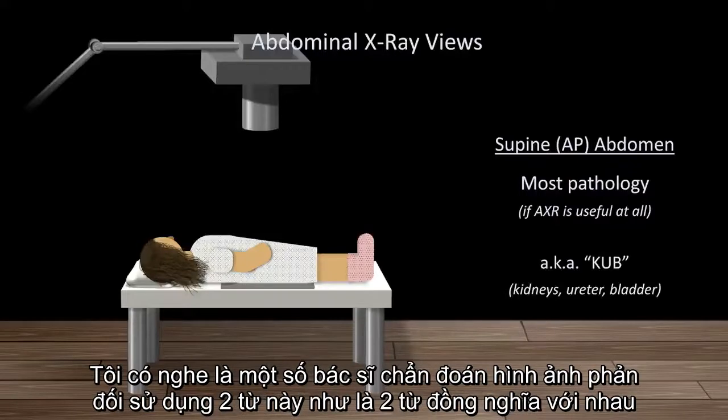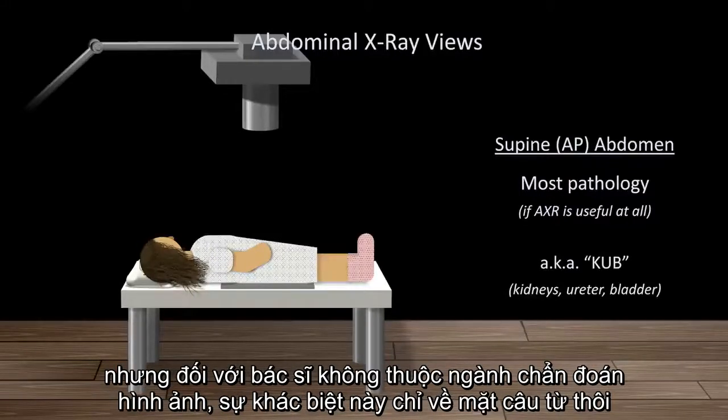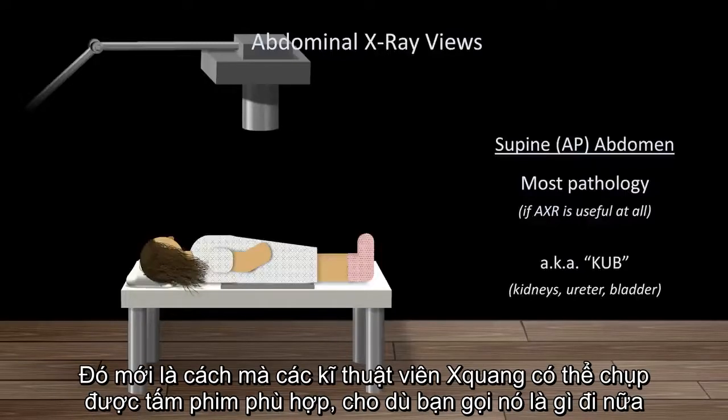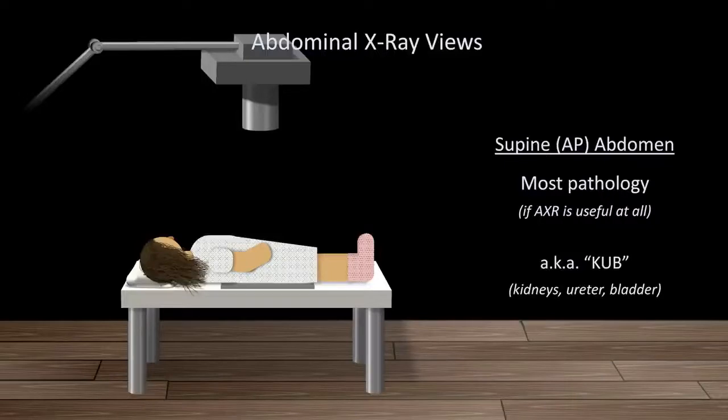I've heard some radiologists object to using these terms as true synonyms, but to a non-radiologist, this difference is semantics, provided that an accurate indication for the test is placed in the X-ray order. That way the radiology technologist can shoot the proper film regardless of what you call it.